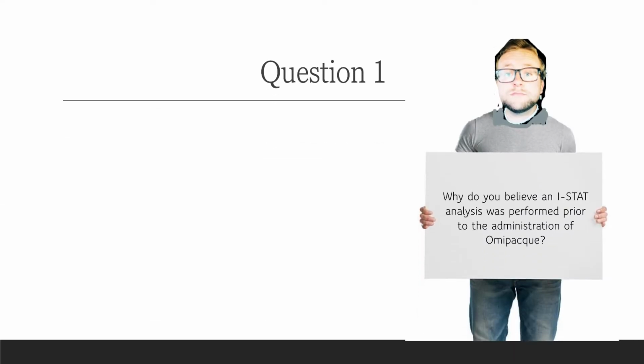Which brings me to my first question for you guys. Why do you believe an iStat analysis was performed prior to the administration of Omnipaque, which, remember, was the contrast used for the CT? I'll let you think about that for a couple seconds. And a little hint, the two values that they tested for with this specific iStat analyzer and for this specific patient were creatinine and GFR, glomerular filtration rate.